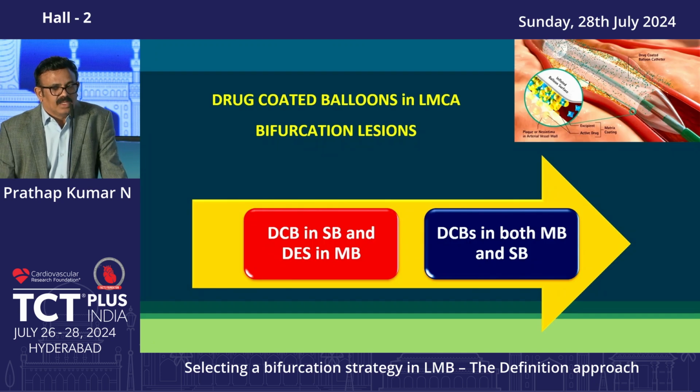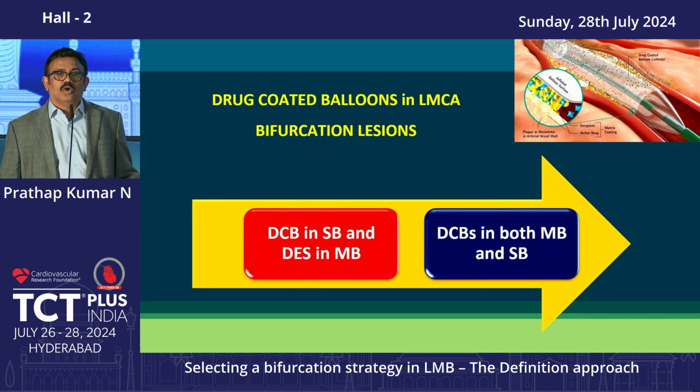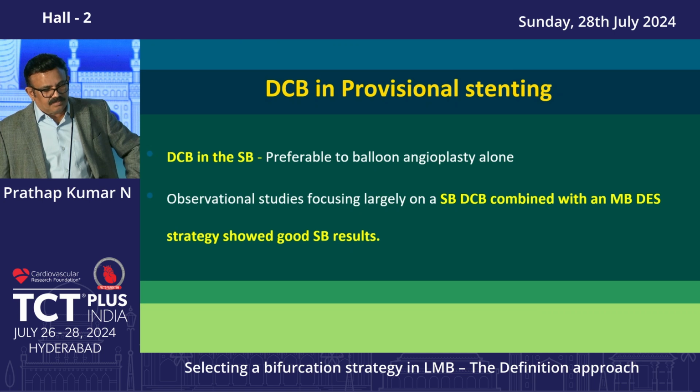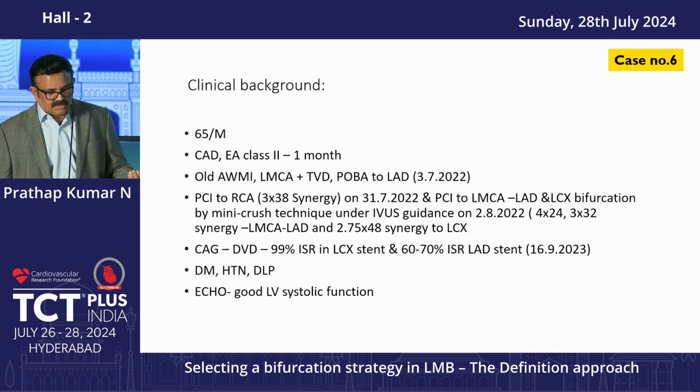This is the next question. Drug-coated balloon in side branch and DES in MB is one choice, or you can use drug-coated balloon in both MB and side branch as done by Praveen Chandra. But I would prefer to use the drug-coated balloon only in the side branch.